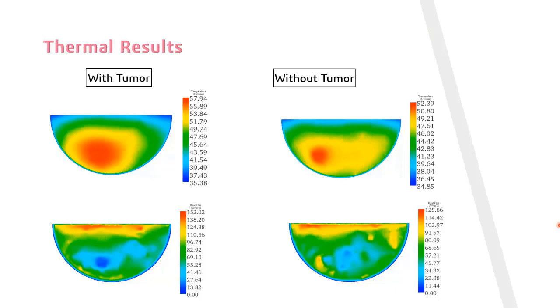The maximum temperature of breast skin for the case of breast with tumor is 57.94 Celsius and for breast without tumor is 52.39 Celsius. As seen here, the presence of the tumor increases the temperature. This raise in temperature does not necessarily kill the cells, but it damages the cells enough to make them more sensitive to radiotherapy or chemotherapy.